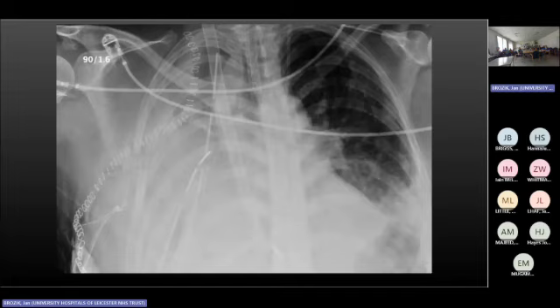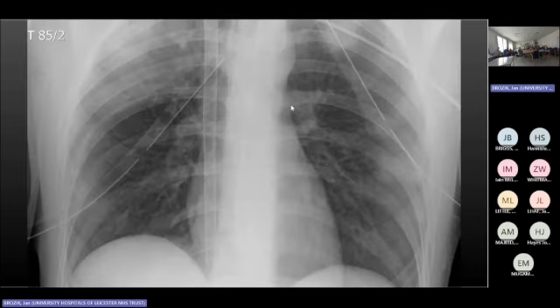Amazing job. Our advantage is obviously bigger screens, but also some experience in putting things together. And there are situations where it really pays off to talk to us. We might get some extra information from you that is not on the clinical request, and we might say, oh, that could be this, and you say no, this is not pulmonary edema because they're dry. Could that be anything else? And then trying to narrow the differential diagnosis.